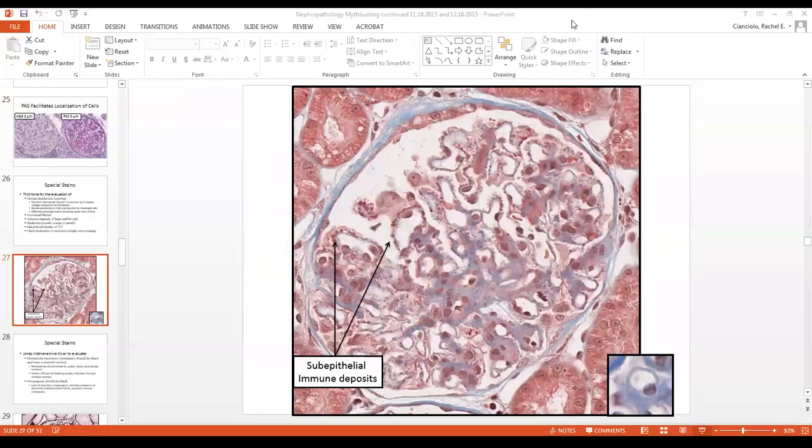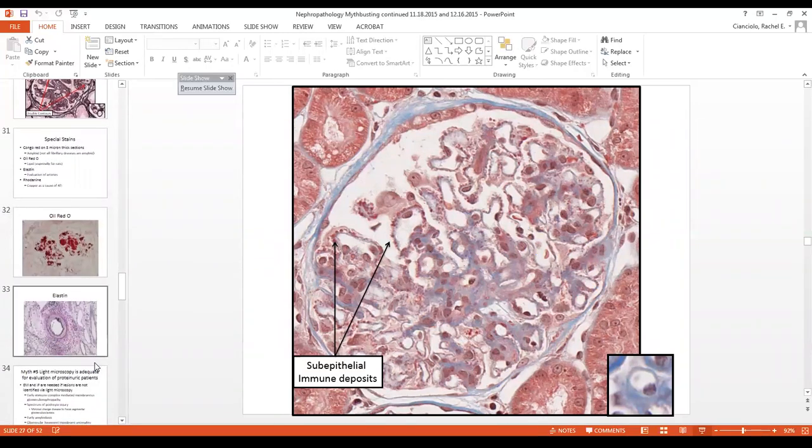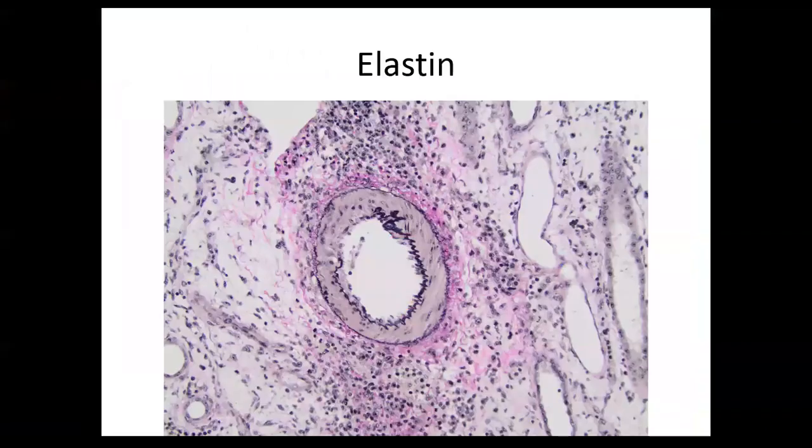They ask, will tubules separate with autolysis? So that's a really good question. Do tubules separate with autolysis? They do. I don't know to what degree they do, and that is actually going to be the summer research project that I'm going to have a vet student help me with. So I'm going to do serial biopsies of dead things to look at how much, and this is a great example of tubular separation. Like this tubule is here and this tubule is all the way over here. That's way too much interstitial matrix.